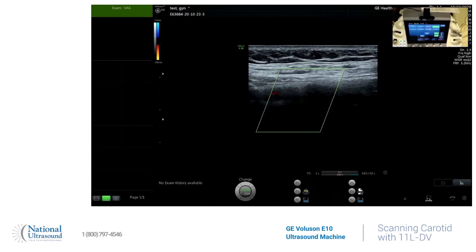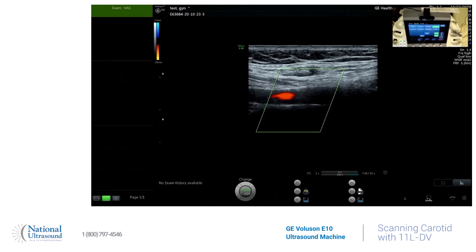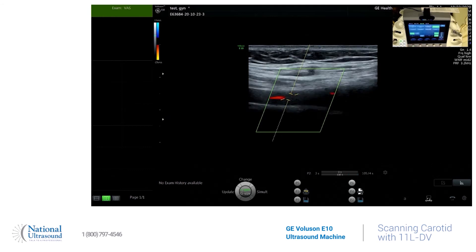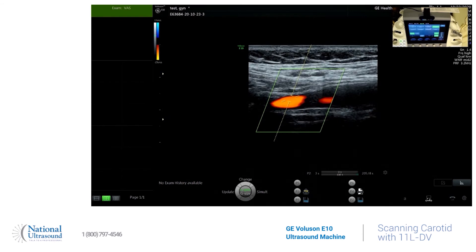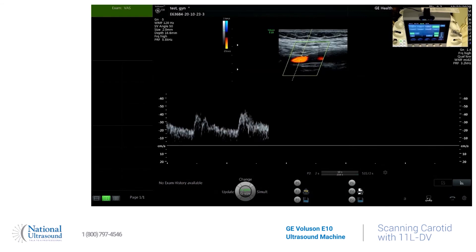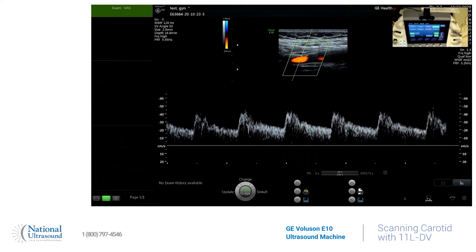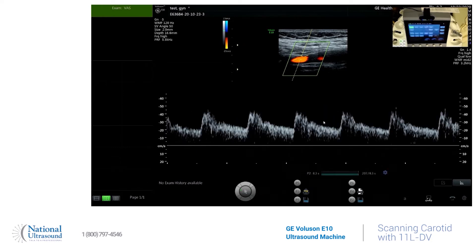Do pulse wave Doppler. This vessel has a low resistance waveform. You can tell from the even upstroke and continuous diastolic blood flow. It has constant blood flow, so it's going to our brain. This is the ICA.